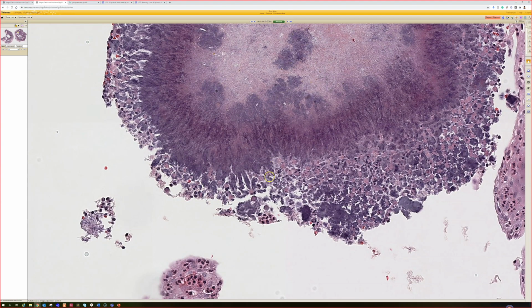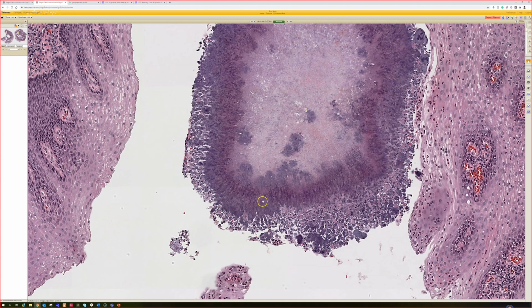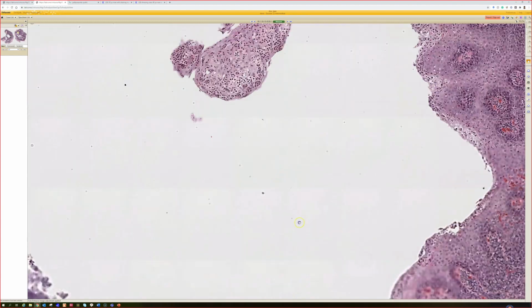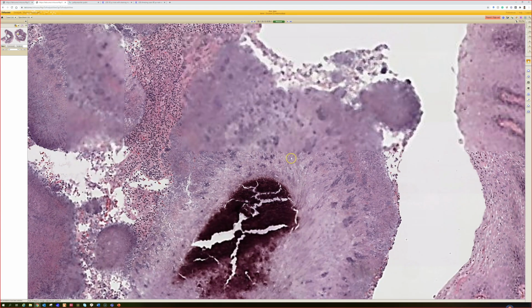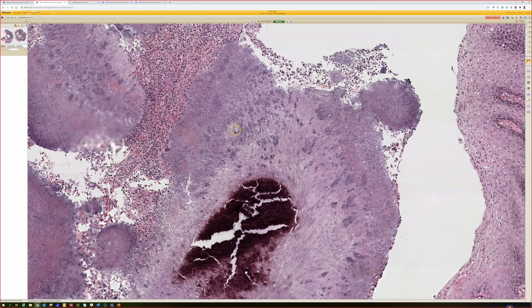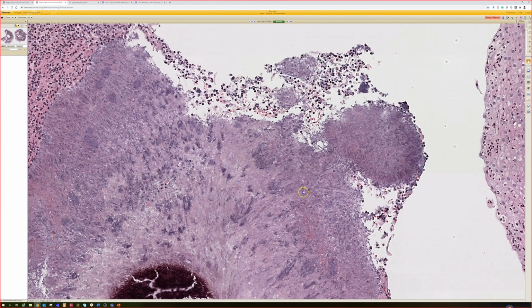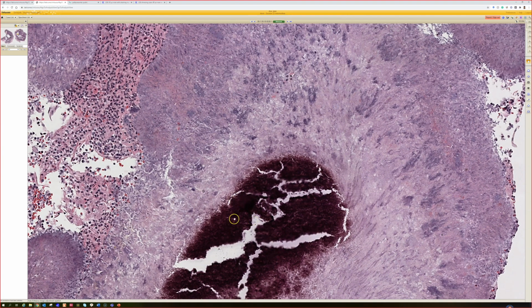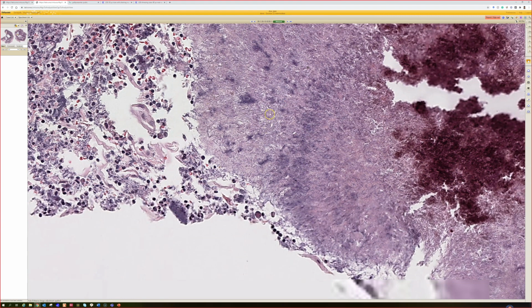Yeah, so these are, we've seen the actinomycosis, the little lumpy grains that we see in that. Exactly. The Splendore-Hoeppli phenomenon, everything in the periphery, and then you can see the bacteria as well. It's kind of hard to see on here, but there are little thin filaments, much smaller.